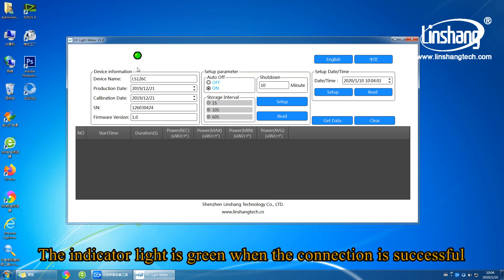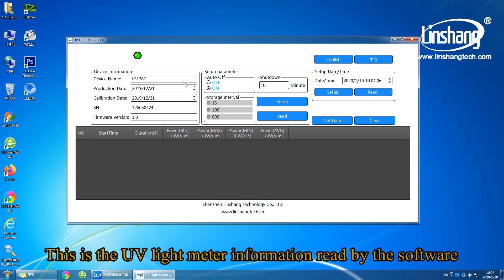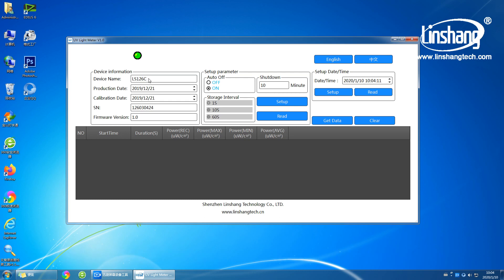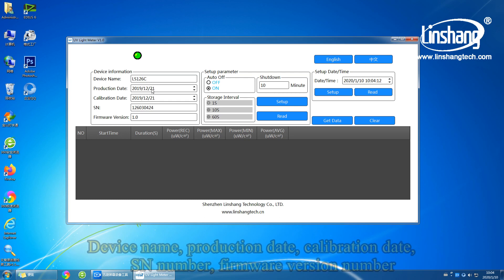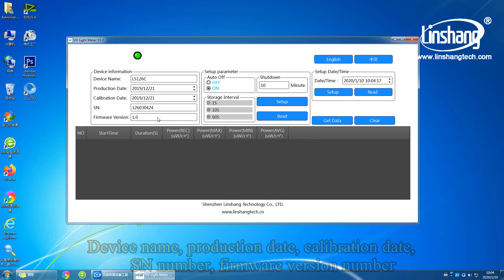The indicator light is green when the connection is successful. This is the UV light meter information read by the software, including device name, production date, calibration date, SN number, and firmware version number.